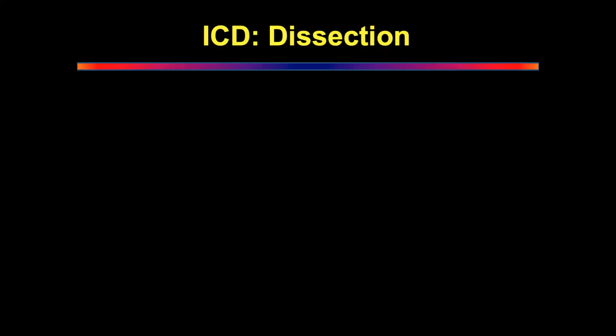In the exam, you do what you like in your practice, I don't care. But in the exam, always say to the examiner, I will not use an obturator because there is a risk of organ damage, please. Okay. So don't talk about sharp dissections. Never. Very dangerous to do. Never do it. Okay. It's my advice to you guys.